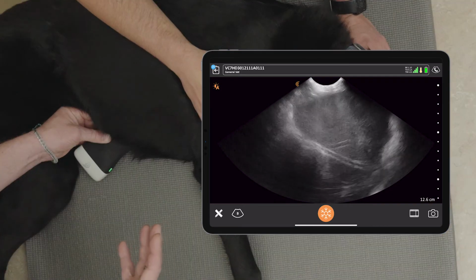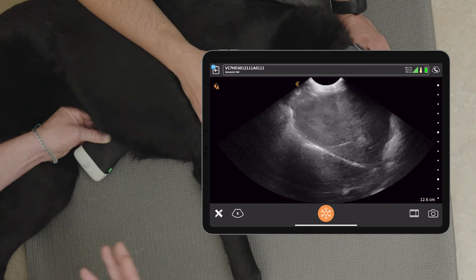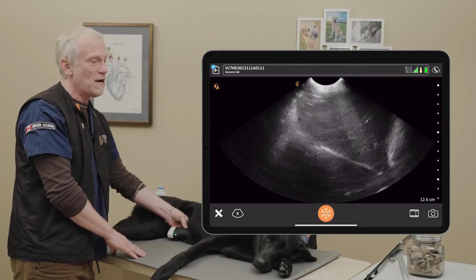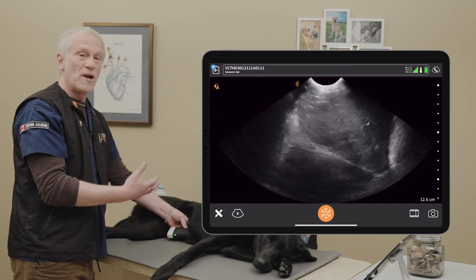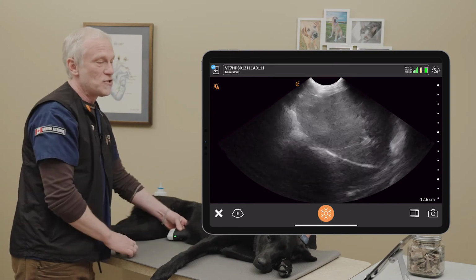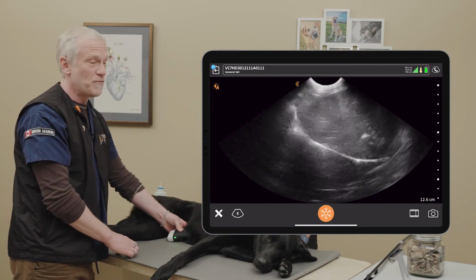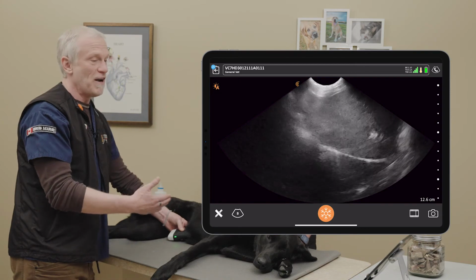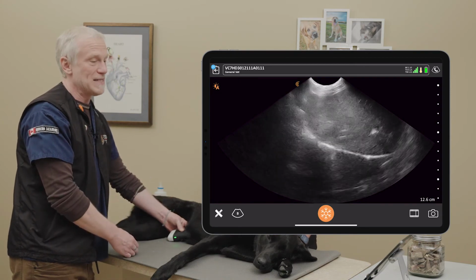And when we switch compressors at that 2-minute mark, we have about a 5-second, 7-second window. I can assess that free wall of the heart right there and say I have ventricular fibrillation or I have no cardiac activity versus I have cardiac activity. So again, one more thing we can look for at that subxiphoid site that's pretty new, but we can assess cardiac activity in our 5-point APOCUS exam at this subxiphoid location.